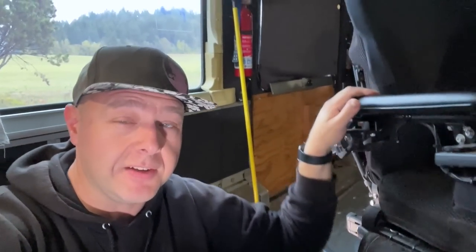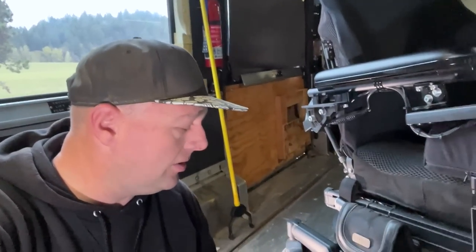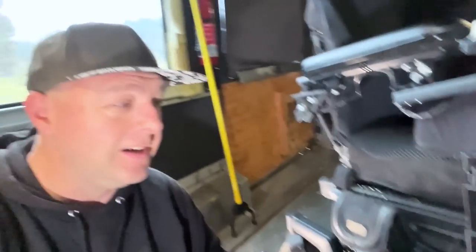I'm actually going to be going back in to see my pulmonology team. Every time I go in I meet with three different people. I just haven't been recovering the way I feel like I should from that trip in California when I had the breathing machine fiasco. Anyway, I can do this video here in the bus. I was going to drive out to the warehouse, but whatever. So I'm going to get this backrest off of here and then look at replacing that hardware and reattaching some of this stuff in a better way.